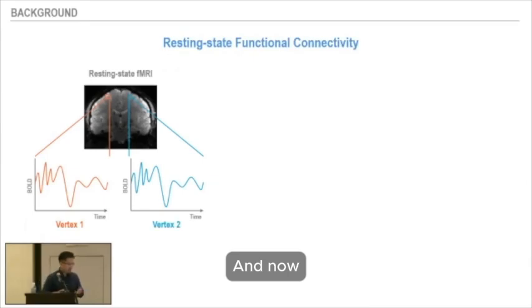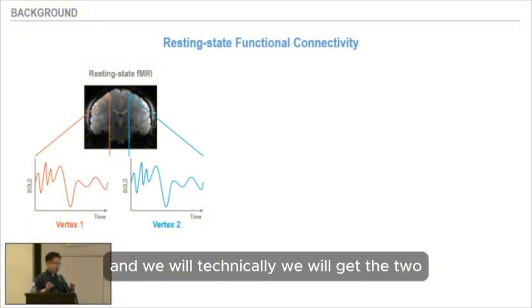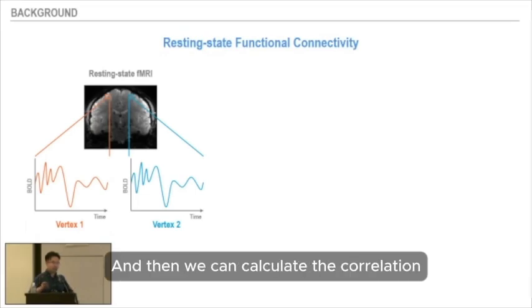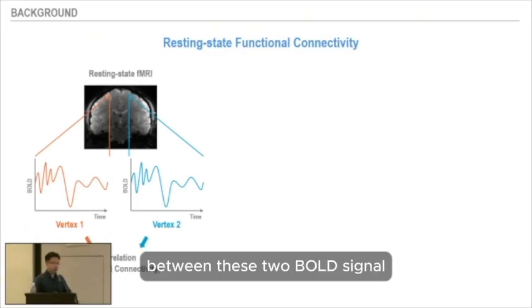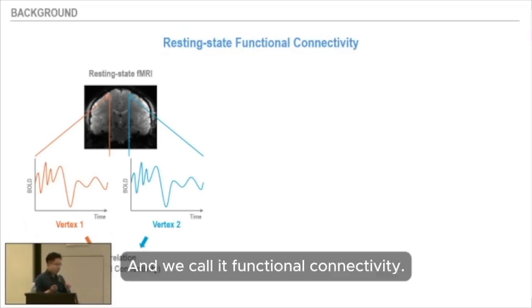Now, if we extract two brain regions from the resting state functional MRI, we will get two BOLD signals. And then we can calculate the correlation between these two BOLD signals to examine how similar these two signals look. We call it functional connectivity.